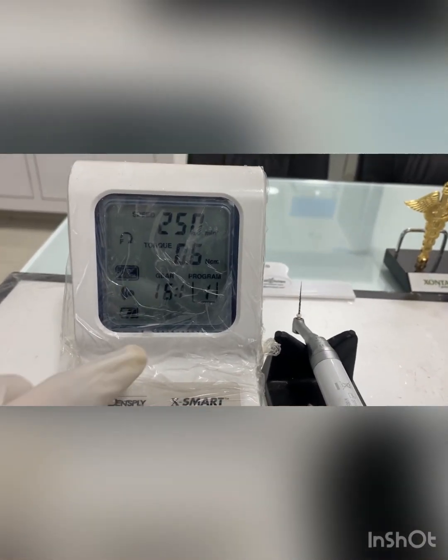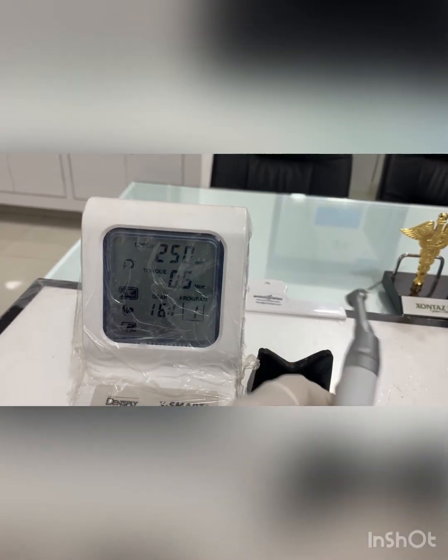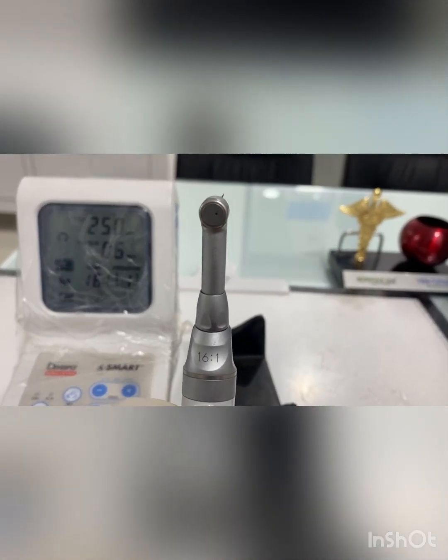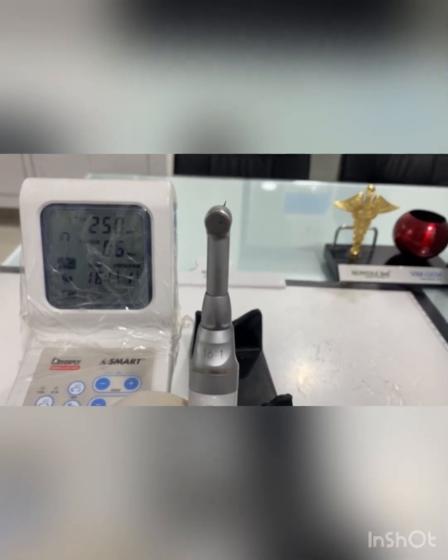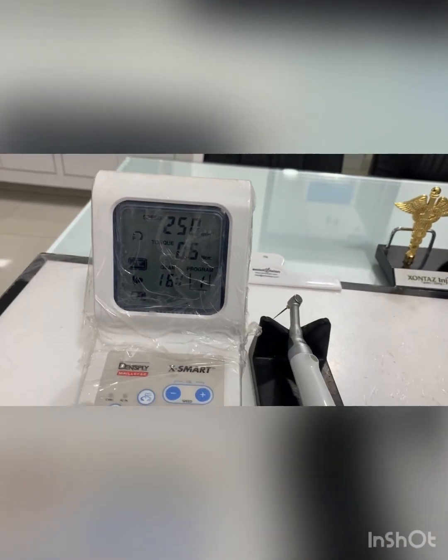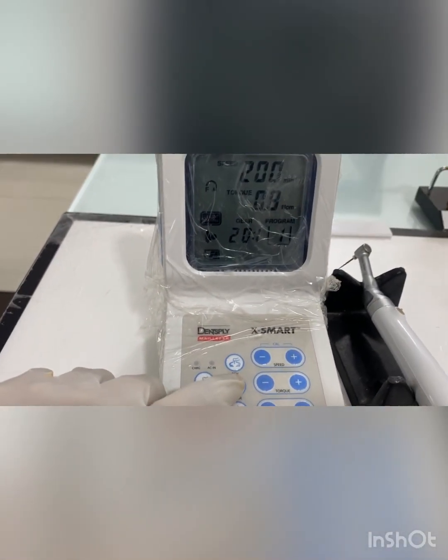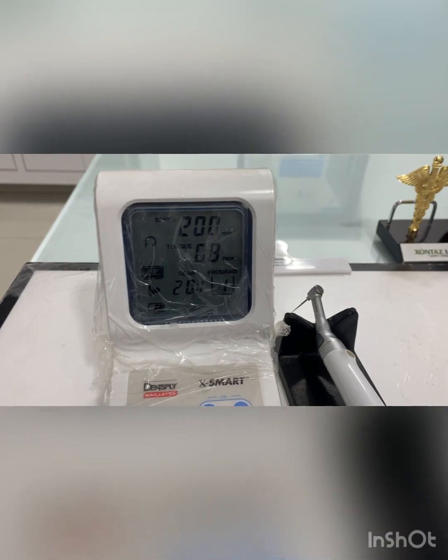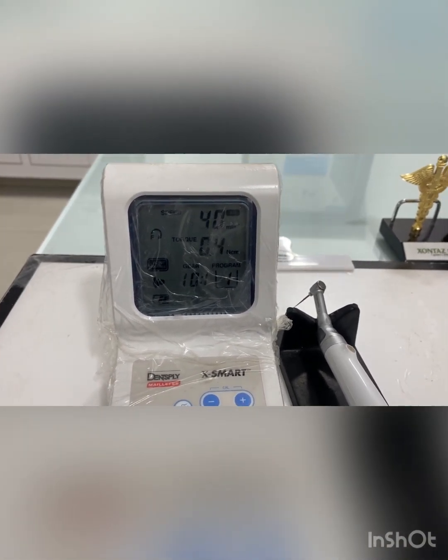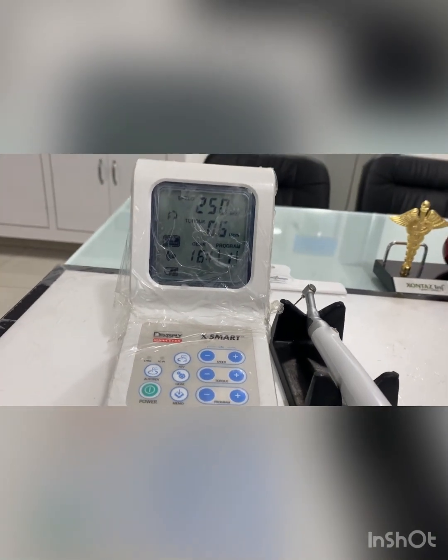The next parameter is gear ratio. You can see it is written as 16:1 on both the LCD and on the handpiece itself. This handpiece works at a gear ratio of 16:1. You can change the gear in the settings, but it depends on what handpiece you are using and at what gear ratio it operates.